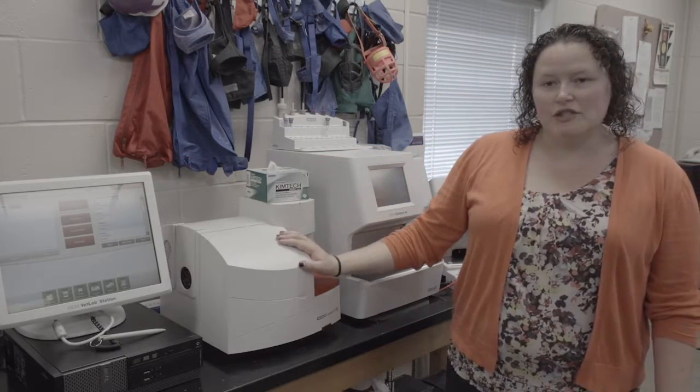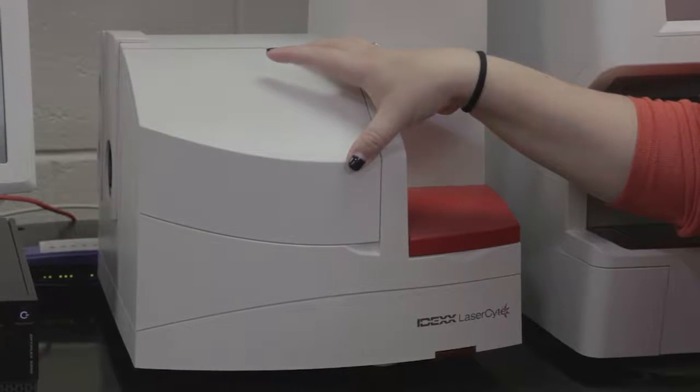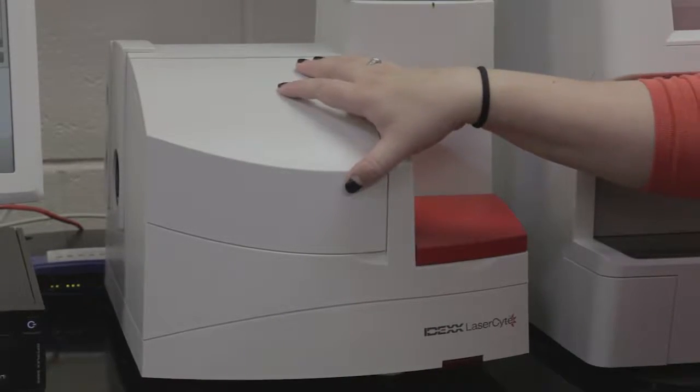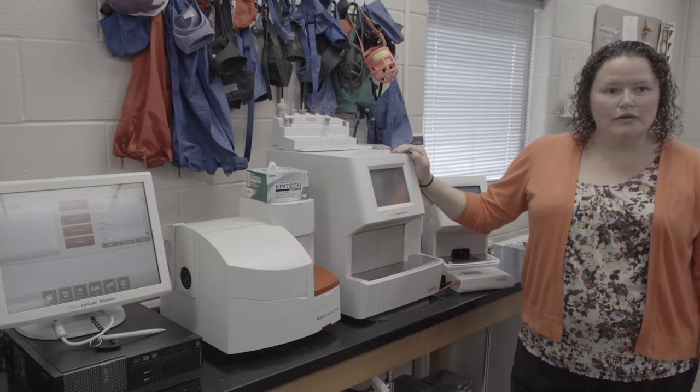Moving down the line, this is your IDEXX LaserCyte. This is your CBC analyzer. This will give you your complete blood count, 5-part differential, reticulocyte count, and it will do all of that in 10 minutes. This big analyzer here, this is your Catalyst.